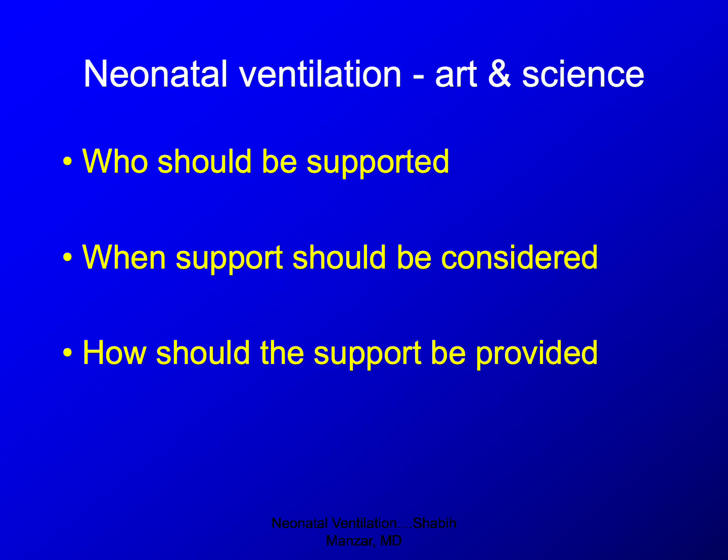So basically, the title says that neonatal ventilation is an art and a science. The scientific part is knowing the physiology of ventilation, while the art part is that you really have to tailor it according to the need of the baby's lung, and the compliance, the physiology of the lung, it keeps on changing honestly minute to minute. And actually we did a study where we looked at minute to minute variation in tidal volume, and it was really interesting, and you guys can google that article. The title is minute to minute tidal volume ventilation difference. So anyway, let's just stick to this talk.